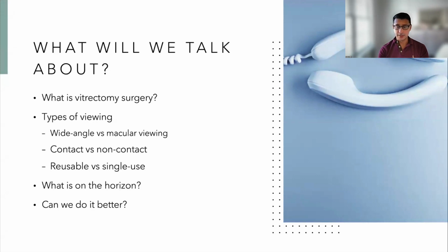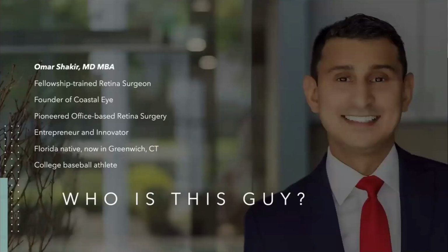Contact versus non-contact meaning, are we in contact with the surface of the eye, the cornea, or are we hovering above? Reusable versus single use: reusable being, from case to case, we can clean, sterilize, and reuse; single use being we open up a brand new product every time. And then we'll talk about what's on the horizon as part of this talk, and can we do it better?